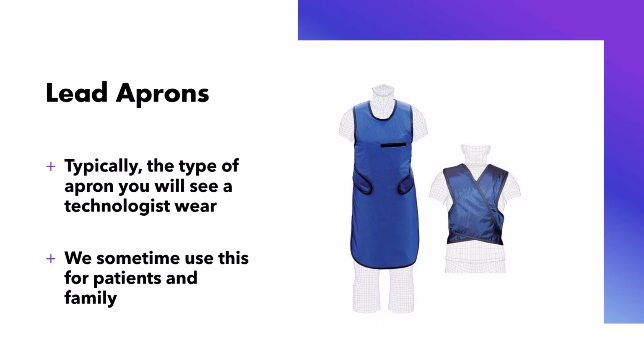Lead shields. This is really a little controversial now. We're going to wear lead shields as personnel when we're in the room where x-rays are being taken. You guys are not going to hold a patient because students can't. But as technologists, there are times when we have to hold a patient. You're going to see this really often in the trauma center. You should have a lead apron on to protect you from the scattered radiation.